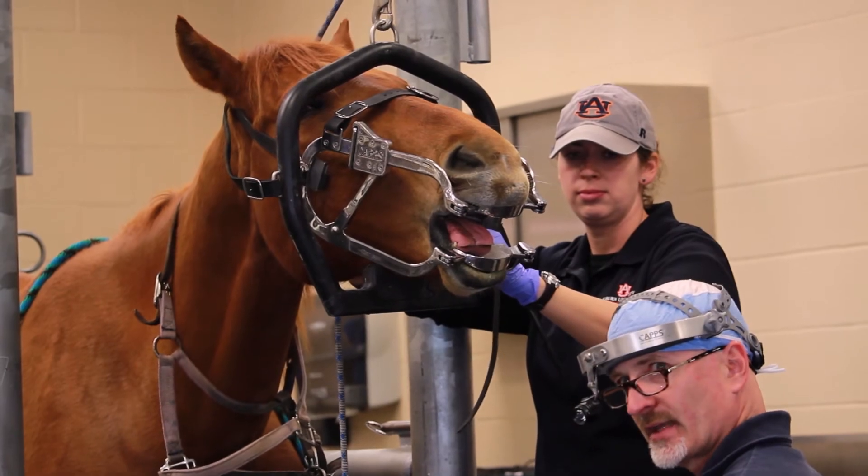The shape and the anatomy of a horse's mouth makes it kind of challenging to actually see into, and being able to put the camera in the horse's mouth and project it up on a large screen TV so everyone can see is just a great, very powerful teaching tool.